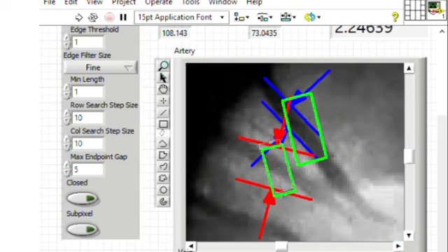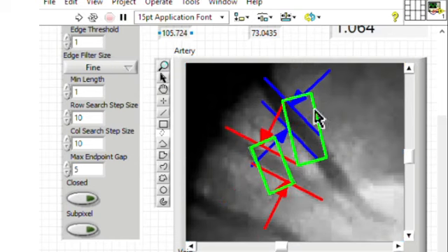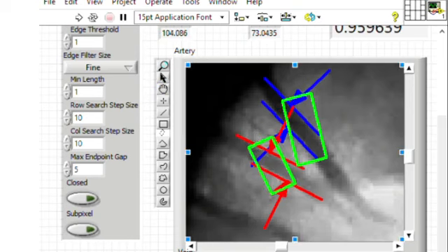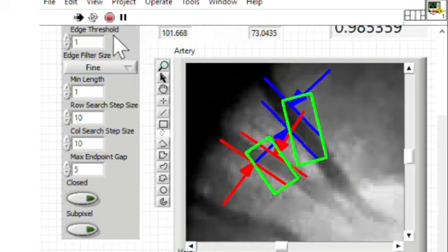Finally, users can use a LabVIEW interface, shown here, to measure the diameter of the arteries and veins in the fundus image. They have to use the clamp function to find the blood vessel edges. The computer can then automatically measure the diameters and report an artery to vein ratio, with which we can tell if the ICP is normal, elevated, or low.